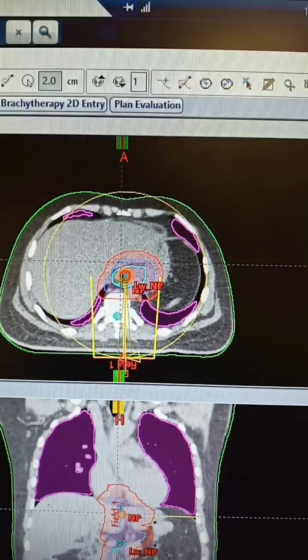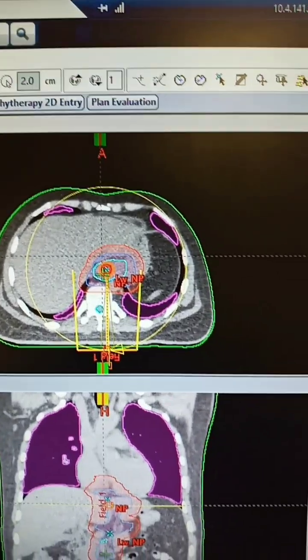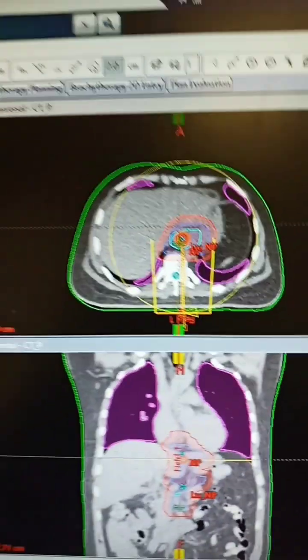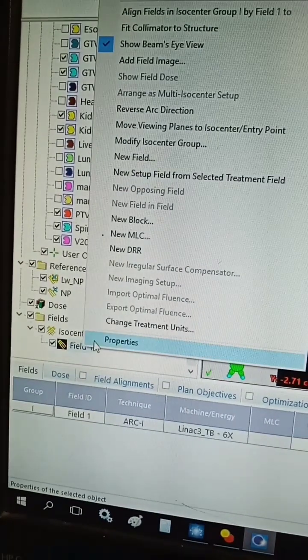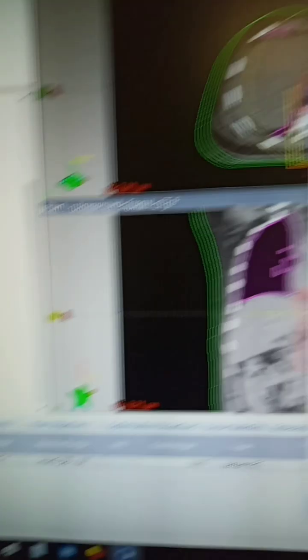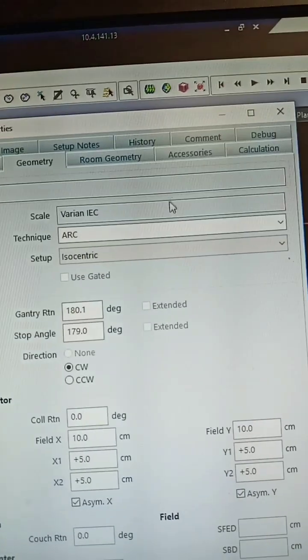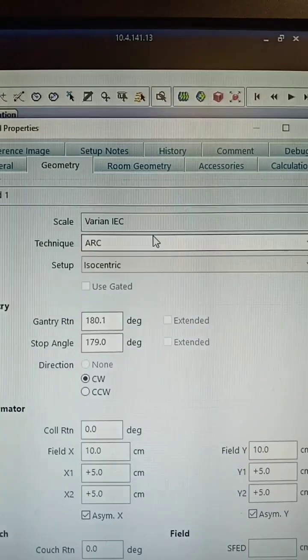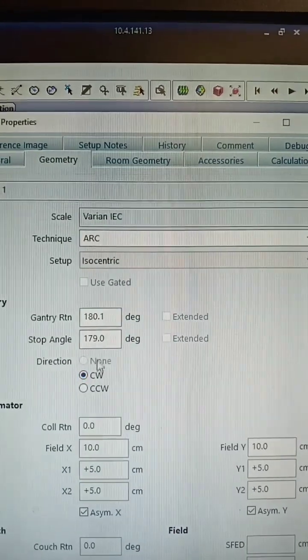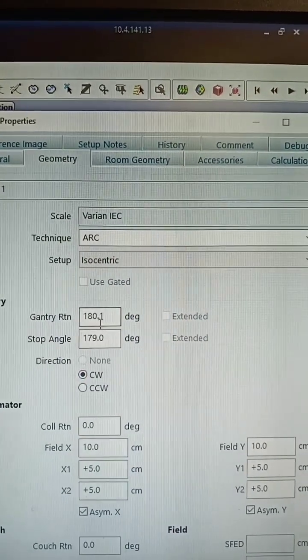Midline tumors are quite suitable for this therapy, like esophagus, and we have to change the property of the field. In geometry, we have chosen the arc and we have set the gantry angles.